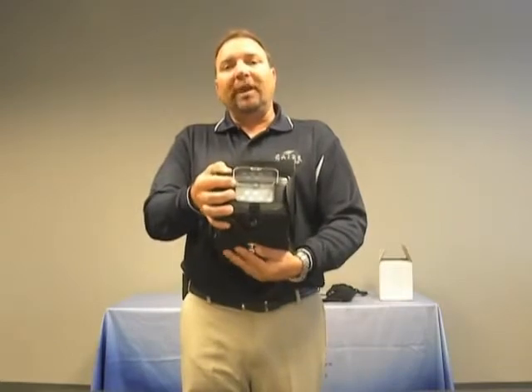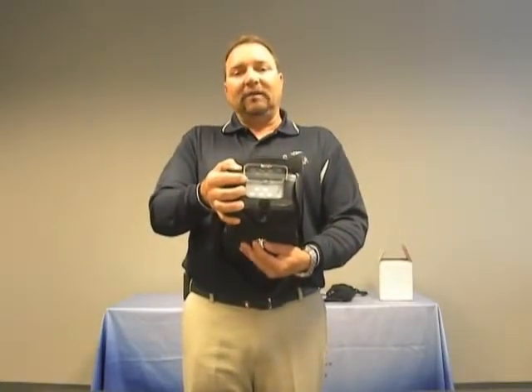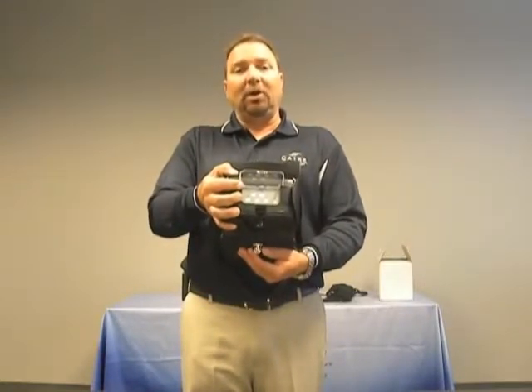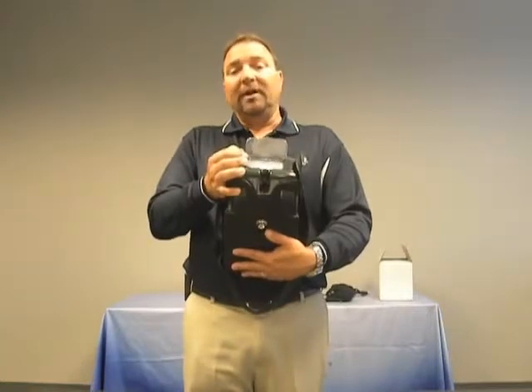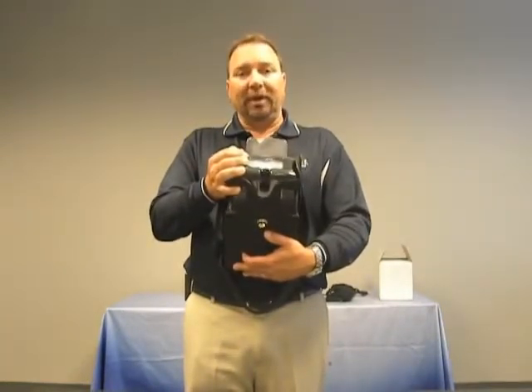The final alarm is a red light alarm, which is located also in the upper right-hand corner. Should you see a continuous red light with an intermittent beeping alarm, that is the alarm where the FreeStyle 5 is not performing within specification and service is required. This would be the only alarm that we have discussed that would require equipment pickup.